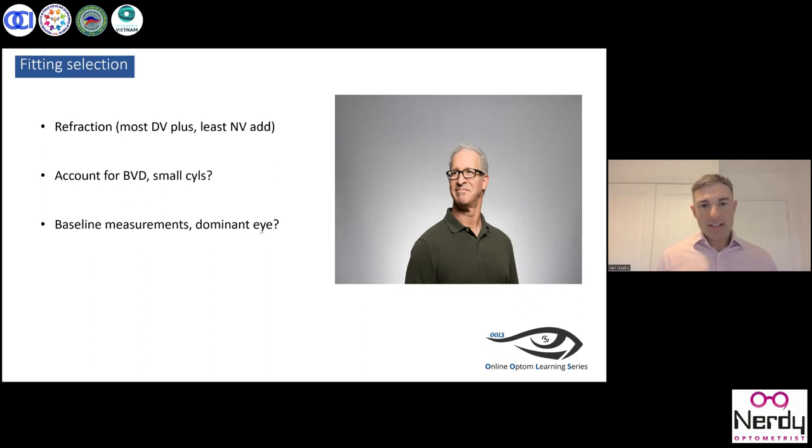Now, with multifocal contact lenses, the literature is actually suggesting that sensory dominance tests are preferred over motor dominance in terms of being linked to success. So that would be using a blur lens to work out the dominant eye rather than a pointing type method.